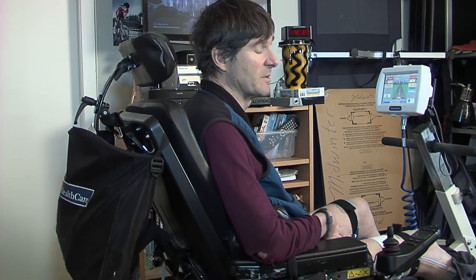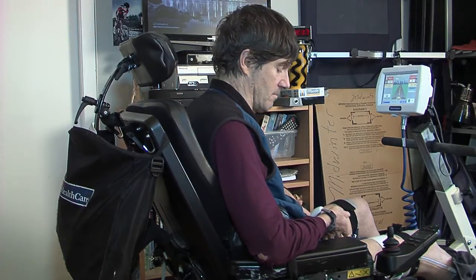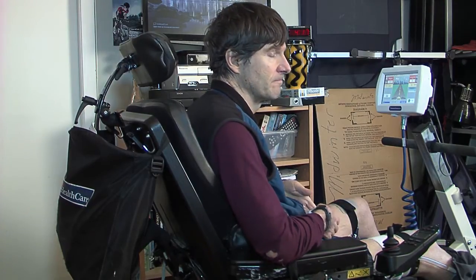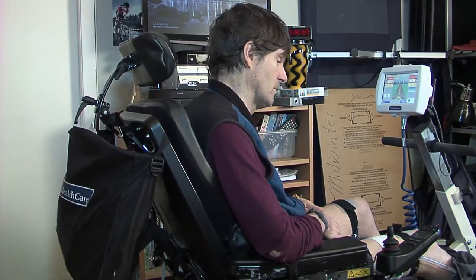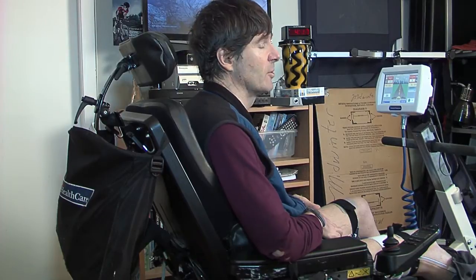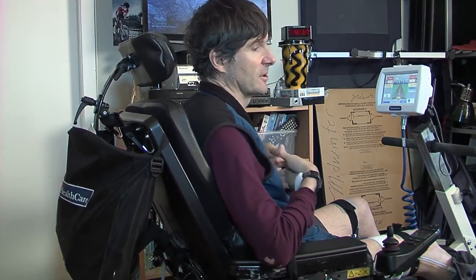Some of the benefits of FES cycling for people in my position include better control of your weight, better blood circulation, better oxygenation of the muscle tissues you're sitting upon, reduced risk of pressure sores, reduced risk of diabetes, better metabolic function, reduced risk of blood clots in your legs, reduced risk of cardiovascular disease, improved lung function, and it just feels great to see my legs moving under their own power.